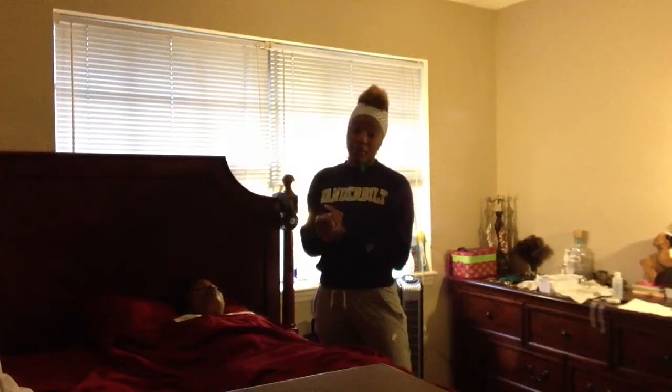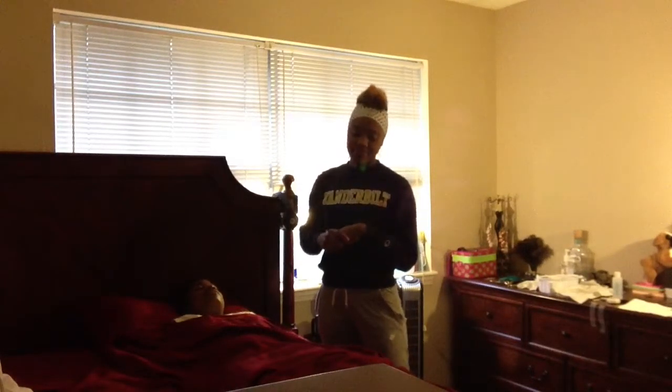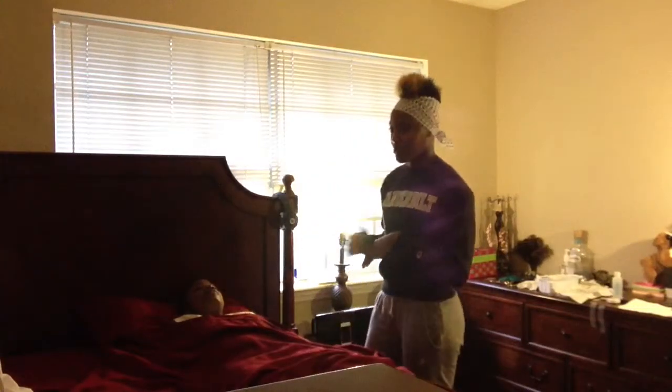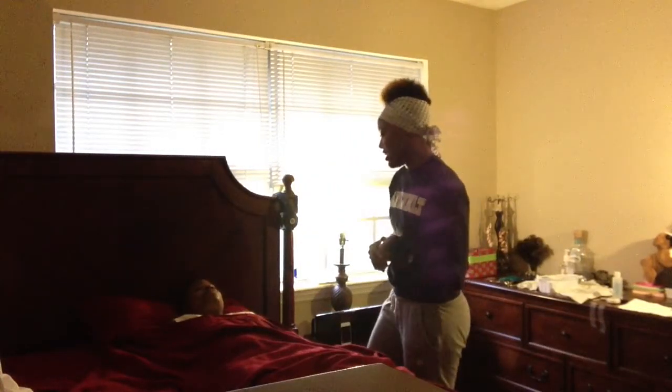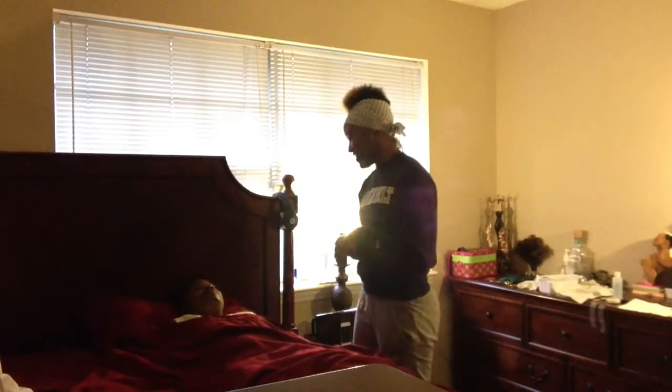I would knock on the door and announce myself. Nursing. Once I enter the room, I want to introduce myself to the patient. Hi, my name is Patrice. I'll be your nurse for today, and you are? Ruby. Ruby, very nice to meet you.